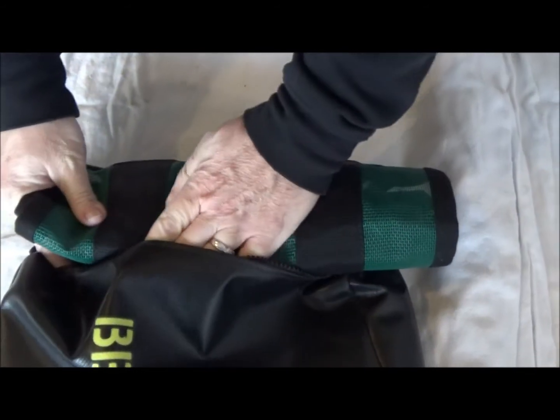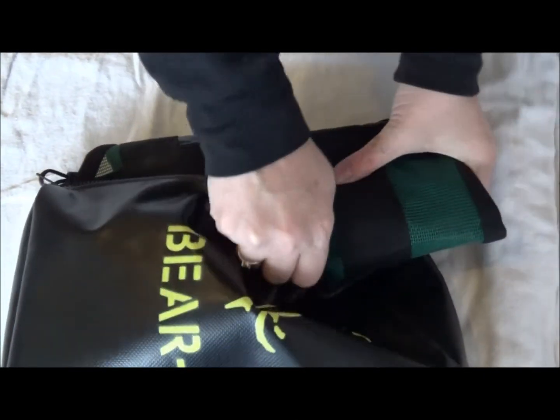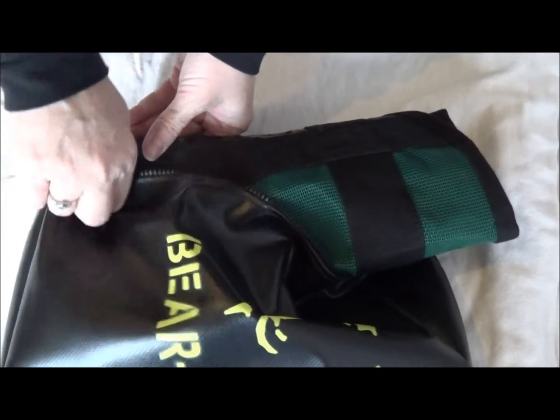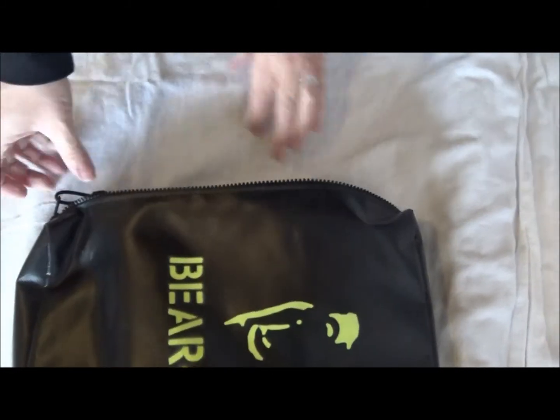Insert one end of the device first and then insert the opposite end into the bag. The device should flatten out naturally once inside the bag. As mentioned before, the more you use this device the more proficient you will become.